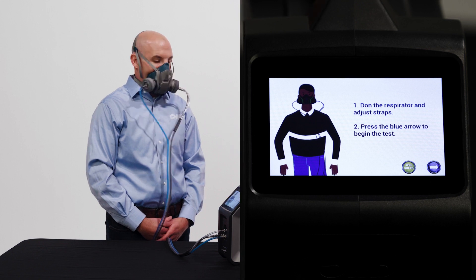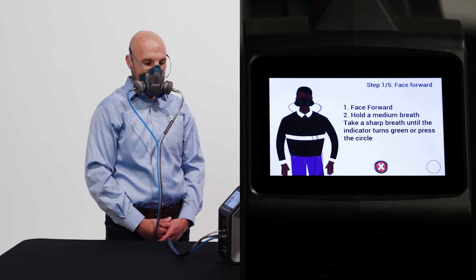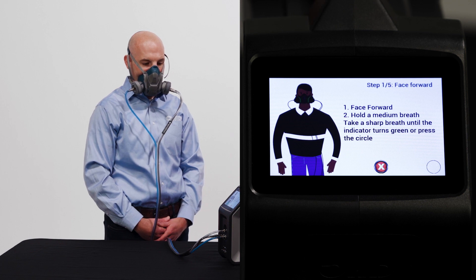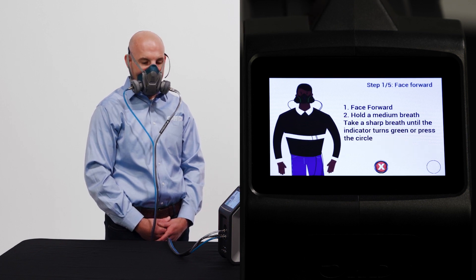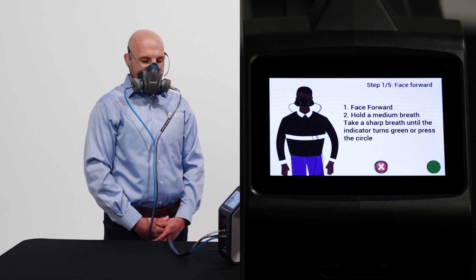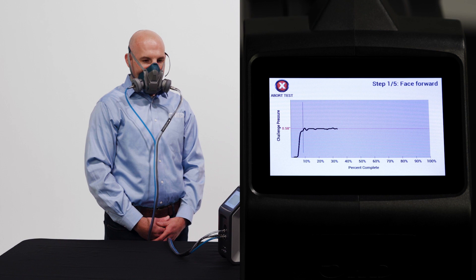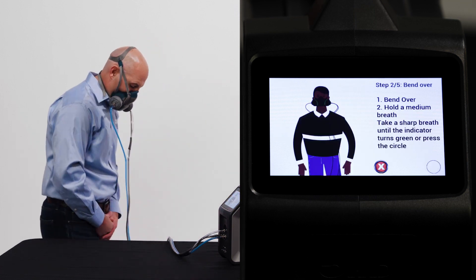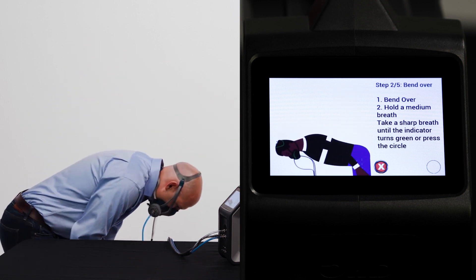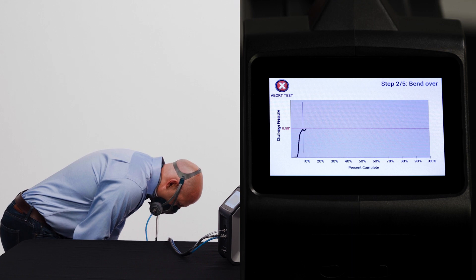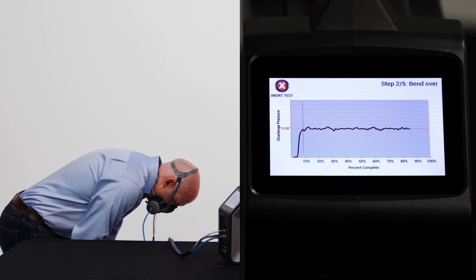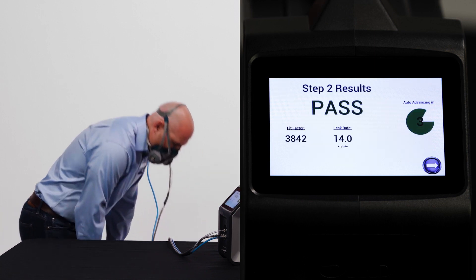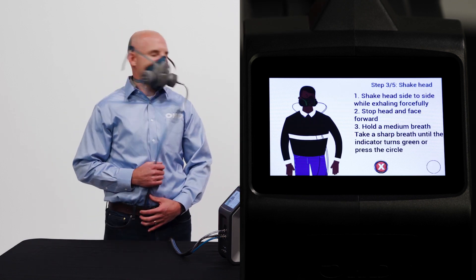Booth is already in the mask, so we'll get started with the test. Step one of the read-on protocol is face forward — when ready, he takes a breath and holds it, and the machine pulls that breathing rate on the respirator. He's holding his breath; the machine is pulling the working rate we talked about and measuring leak into the respirator. If Booth gets a pass, as he did, he moves to step two. The key is the subject takes a breath and holds it — the requirement during the test — while the machine, virtually acting like their lungs, pulls that working rate as they perform the different movements.